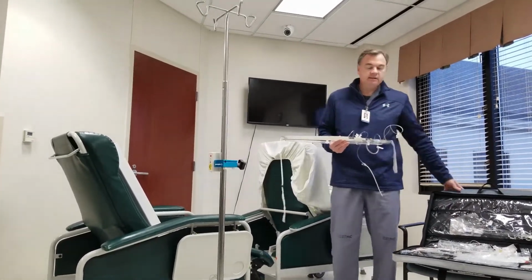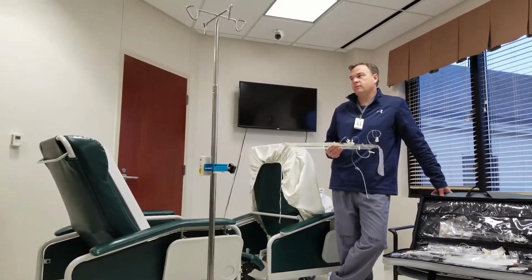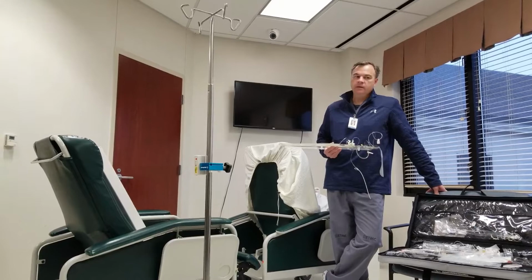Usually, you see these run for 48 to 72 hours. I think Dr. Pelosa, you guys took it out on Thursday and put it in on Monday. That's pretty much the longest you'll see it. Taking it out, a couple things.